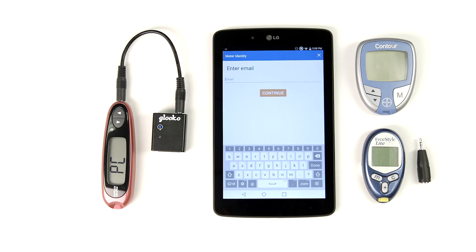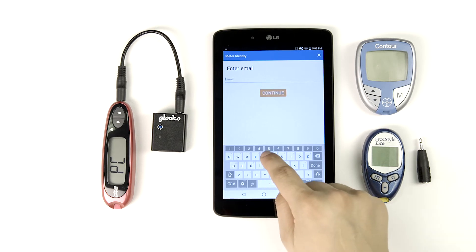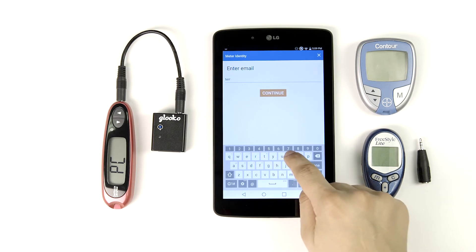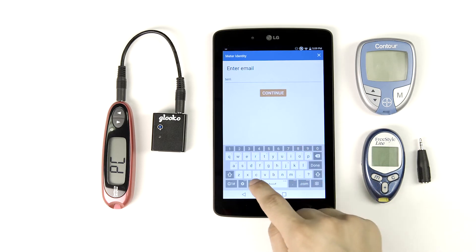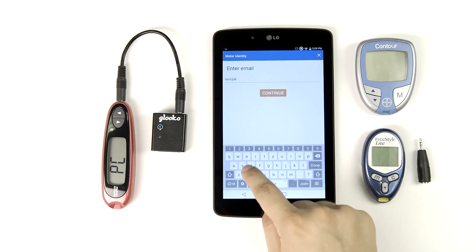The email address is the final piece of data you need to enter. The email is important because it lets your patient have access to their synced diabetes data from their home computer. If your patient doesn't have an email address, no worries, just tap Continue.